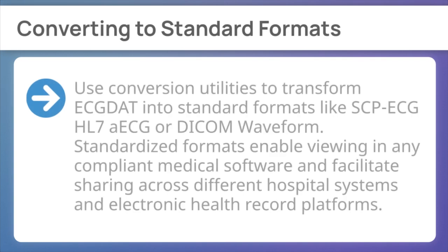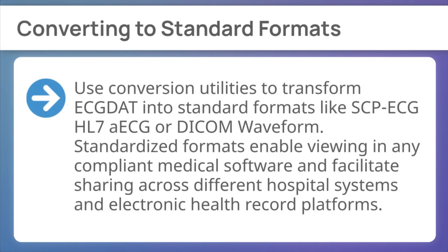Finally, converting to standard formats. Use conversion utilities to transform ECGDAT into standard formats like SCP-ECG, HL7 aECG, or DICOM waveform. Standardized formats enable viewing in any compliant medical software and facilitate sharing across different hospital systems and electronic health record platforms.